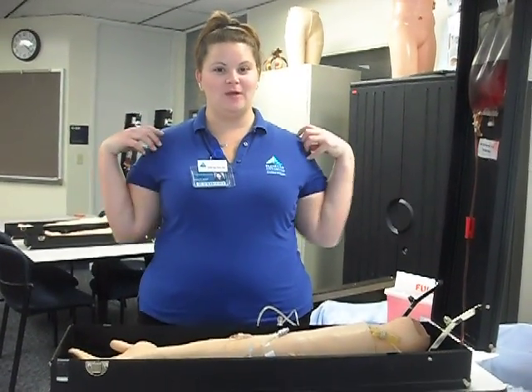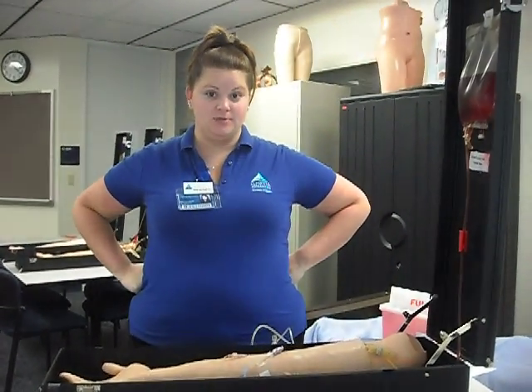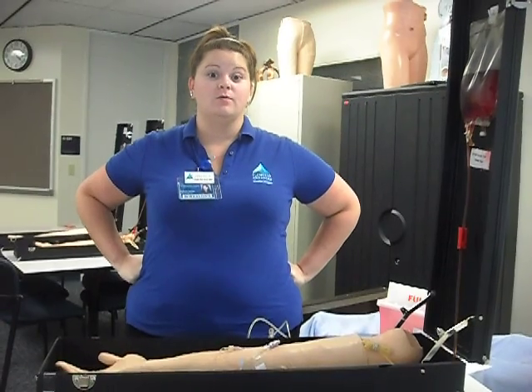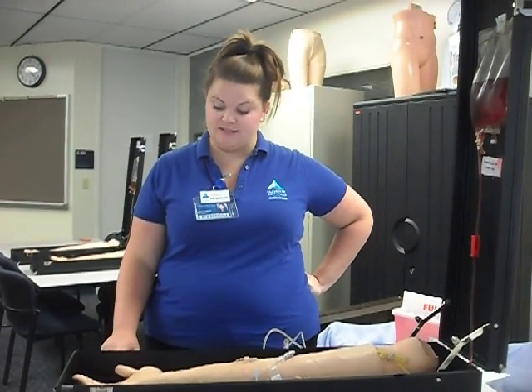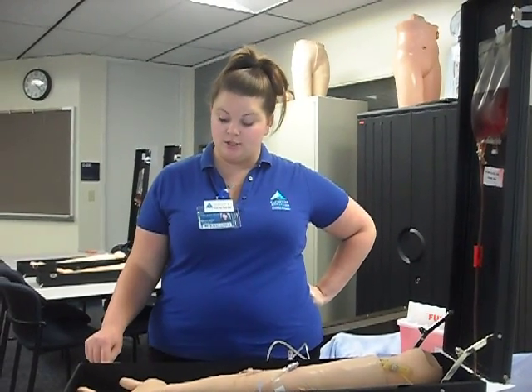Scott again. I'm going to demonstrate a mini bag. I'm in the med room and I'm going to check the doctor's orders. I'm going to check allergies and lab values, and today the doctor has ordered Rocephin, which is an anti-infective and it binds to the cell wall causing death. And contraindications are allergies to cephalosporins with side effects of nausea, vomiting, and rash.